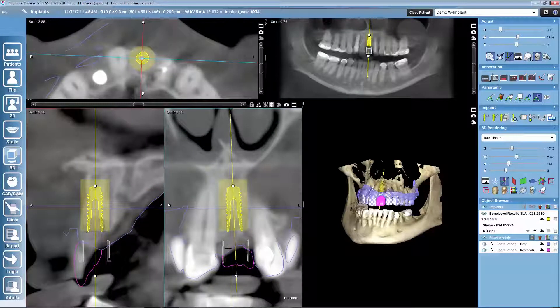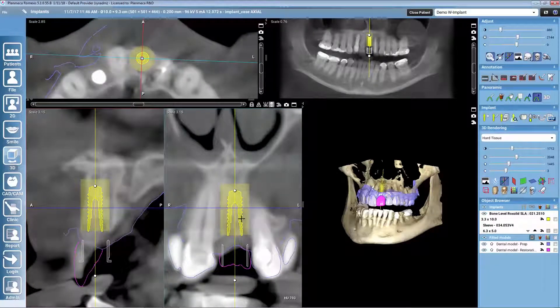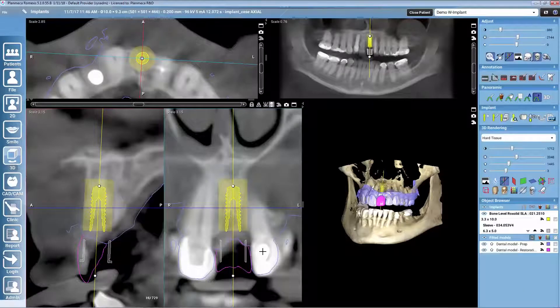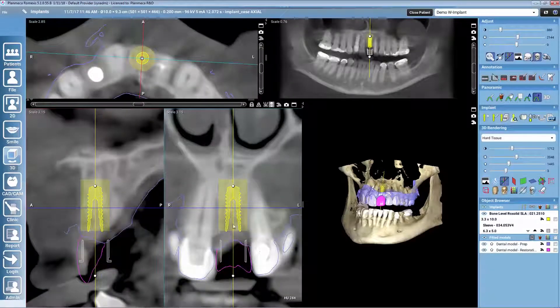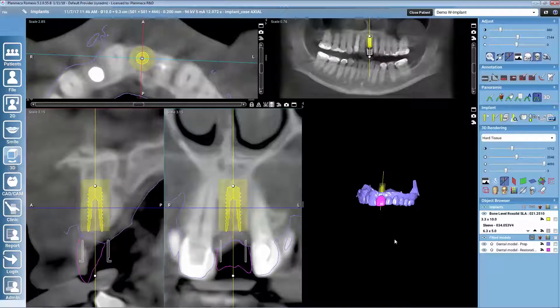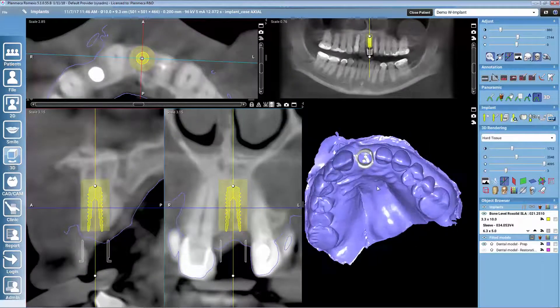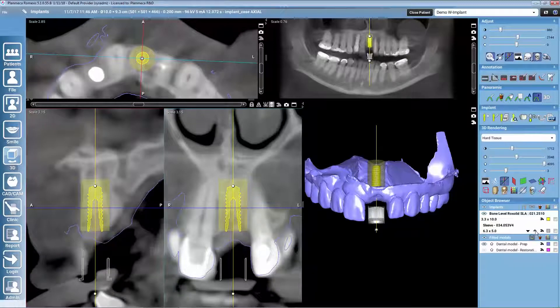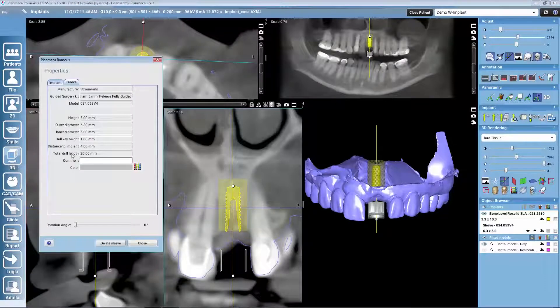I can also see the cuts from the restoration design here, giving a good overview of how I want the implant to be positioned. Once we have found the good place for the implant, we can look at the sleeve. We can see clearly from the rendering that the sleeve is entering the gingiva a bit, so depending on the implant manufacturer we may be able to adjust the sleeve position to different heights. Once the wanted height is selected, we can also check the needed drilling length from the sleeve properties.